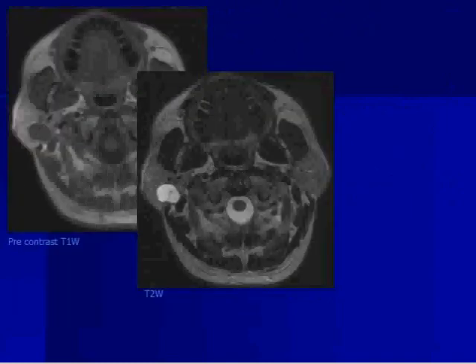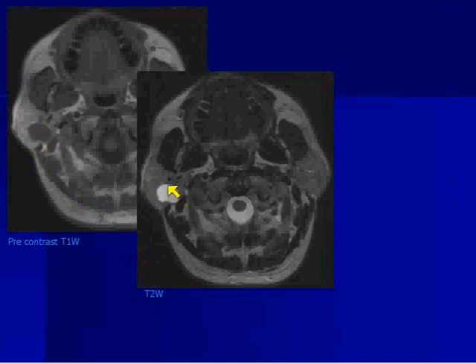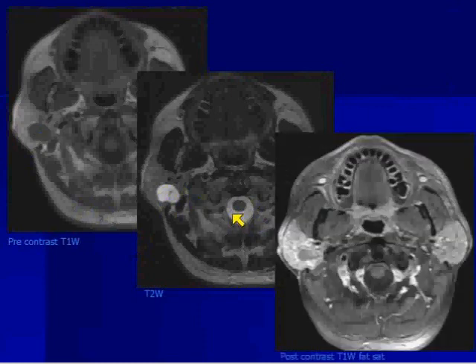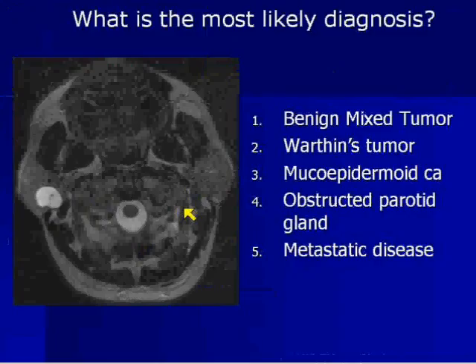We already saw the tumor in pre-contrast T1 — looks pretty well-defined. Look at this lesion down in the parotid gland. It is so bright, bright like a light bulb. Look at how it matches the signal intensity of CSF. This is very important. It enhances — it could enhance variably — but the whole point of this is the T2-weighted sequence.